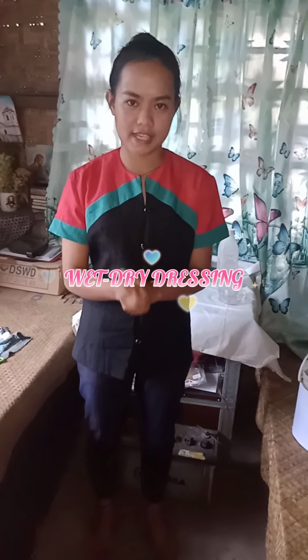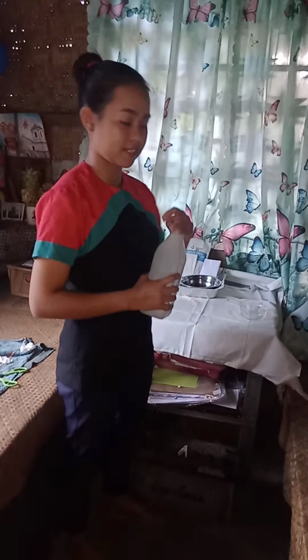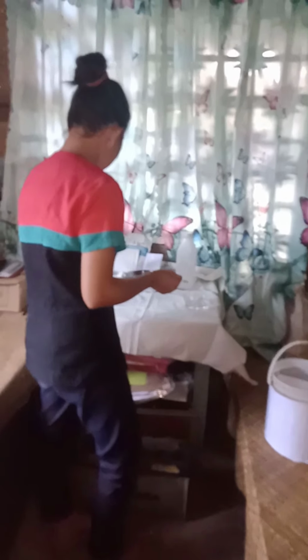So let's proceed to the wet to dry dressing. So first things first, we need to pour this prescribed solution into the sterile basin and add some fine mesh gauze.